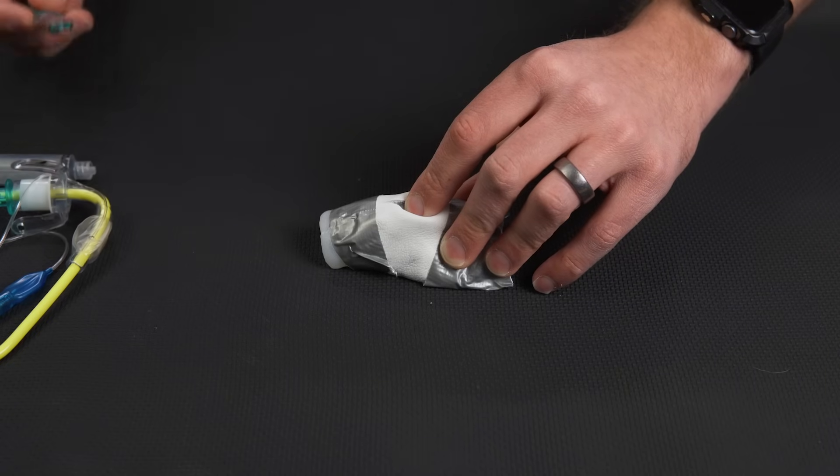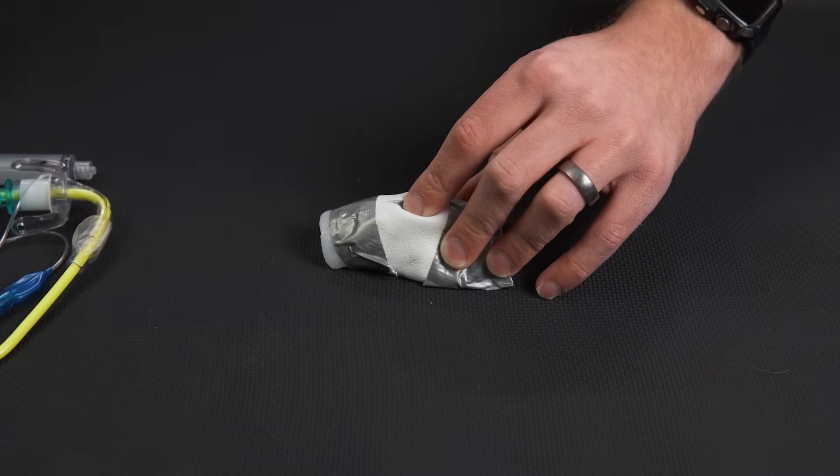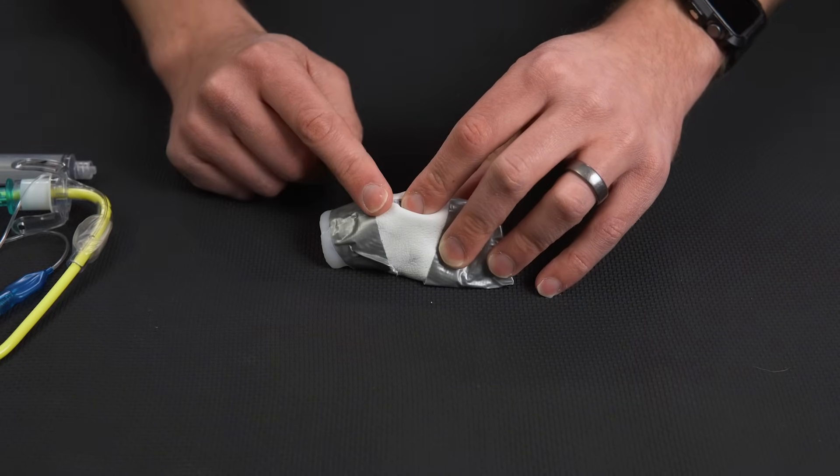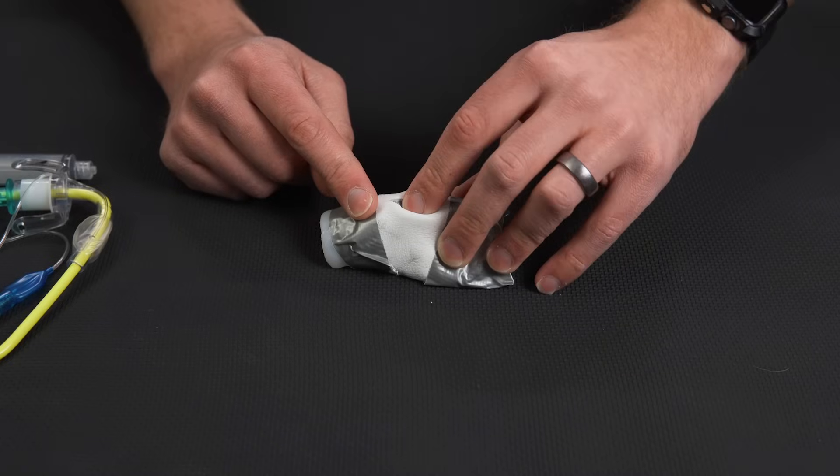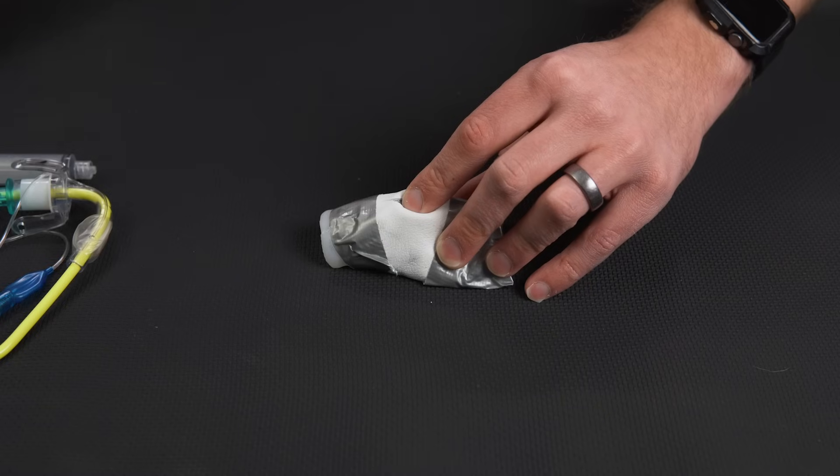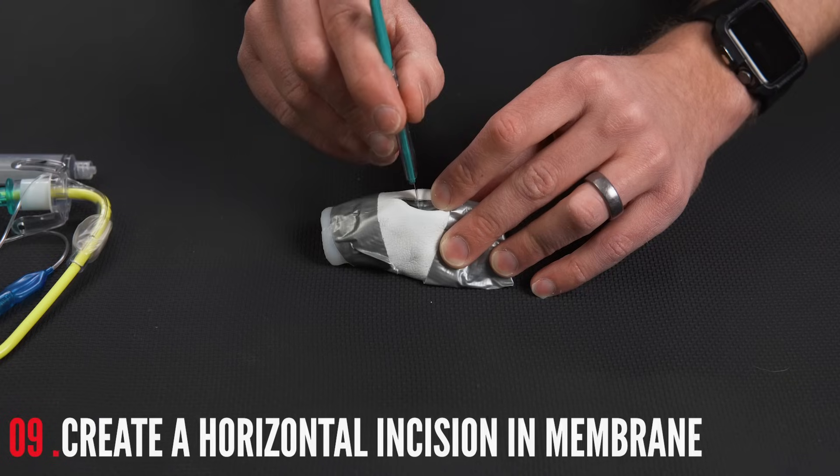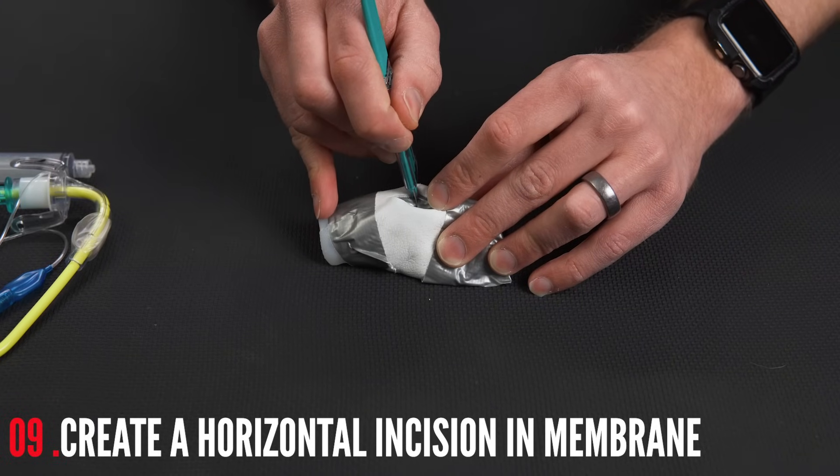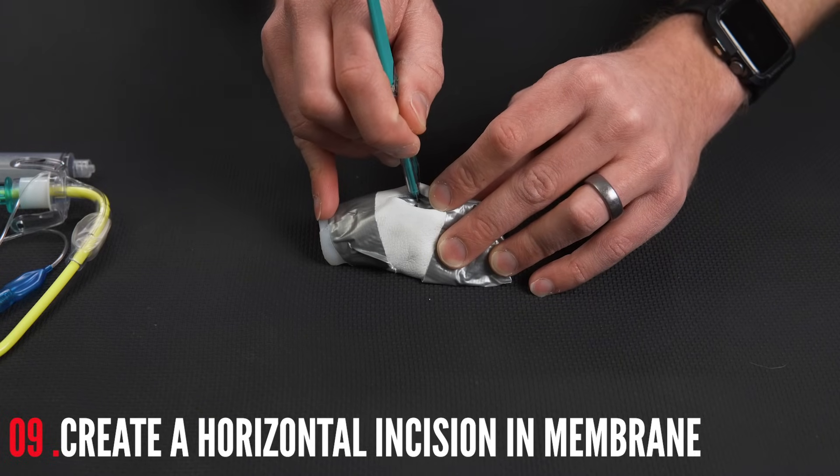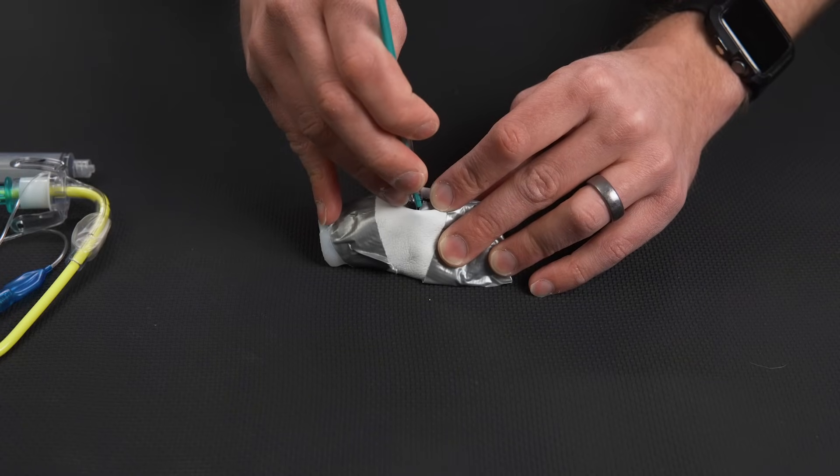From this point on, this procedure is actually a tactile procedure. You do not need lights or even visual cues to tell you where it is. That's really important because periodically these will become extremely bloody and you're going to have to insert blind. Through here, I have that space. I'm going to take the scalpel back up and now I'm going to make a puncture down into that membrane.